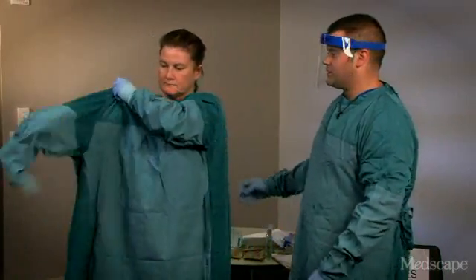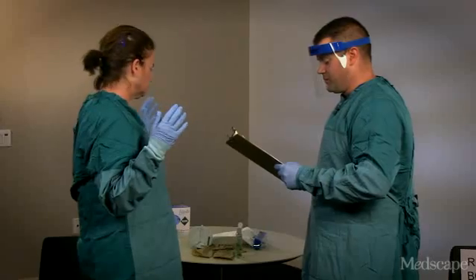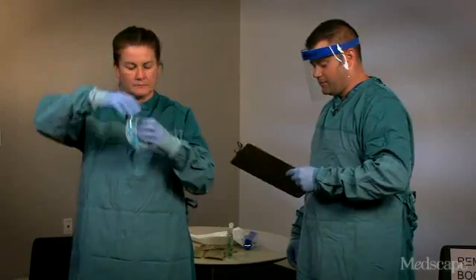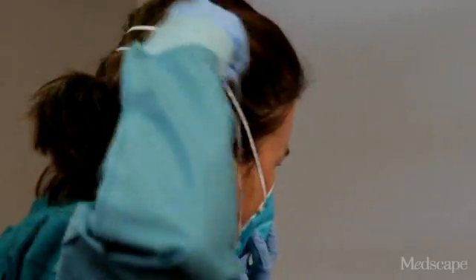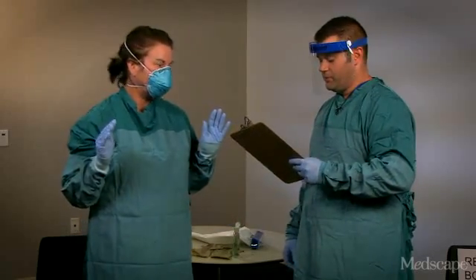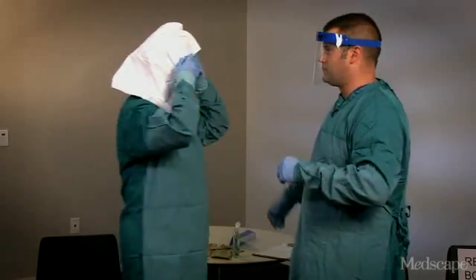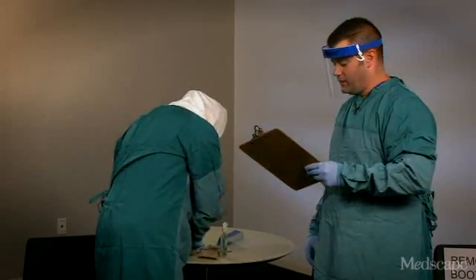And as the trained observer, I can assist with the gown. Next, Barbara is going to put on the N95 respirator and put the top strap first over her head and keep it above her ears. The bottom strap goes along the back of the neck. Barbara is then going to check to make sure that there's a seal. Barbara is now going to put on the hood and pull it down to cover her hair and ears. Next, she's going to put on the second pair of gloves and make sure the cuffs are pulled over the sleeves of the gown.